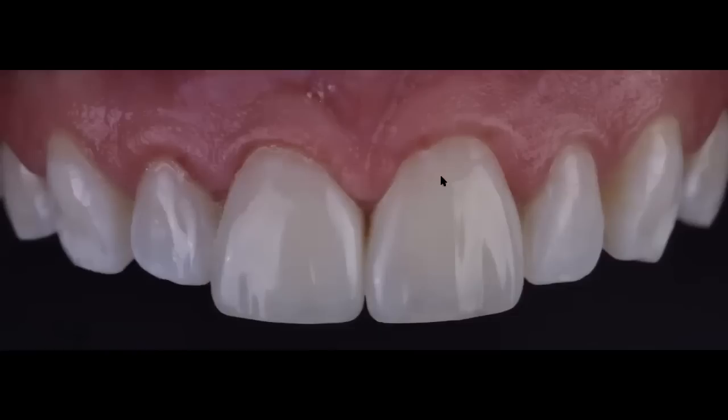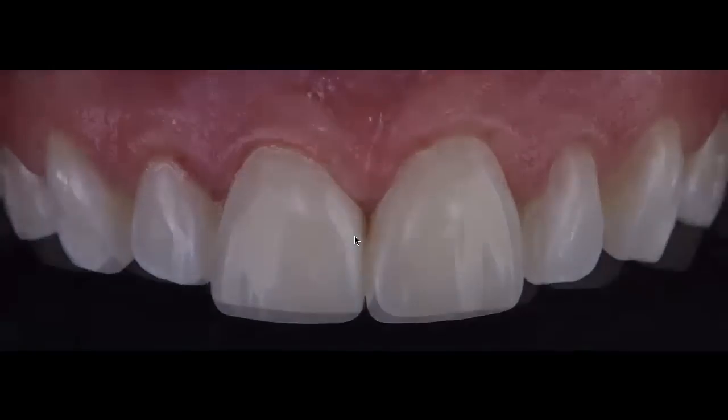You can see that it's almost invisible, the transition line between the enamel layer and the actual tooth structure. But you can see that my restorations did not go all the way to the gingival margin, but I will allow the tooth to rehydrate. Again, always tell your patients you're going to have to wait for that.